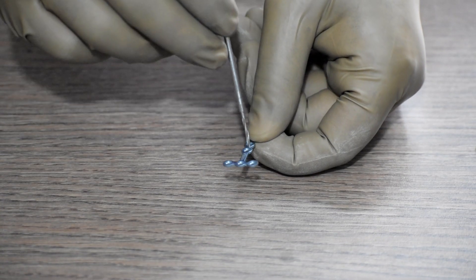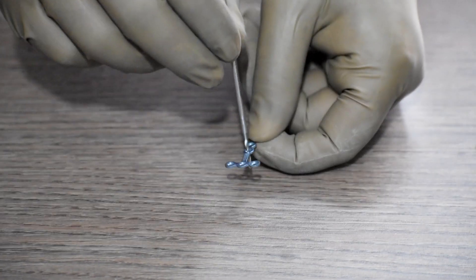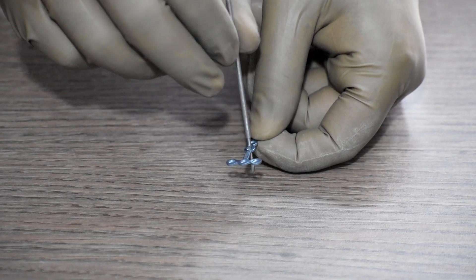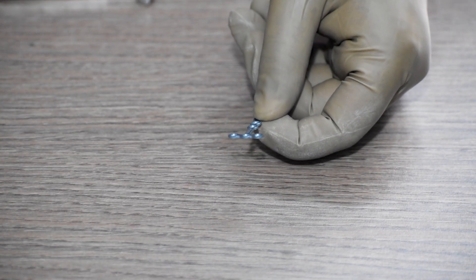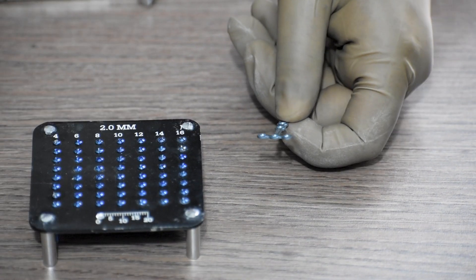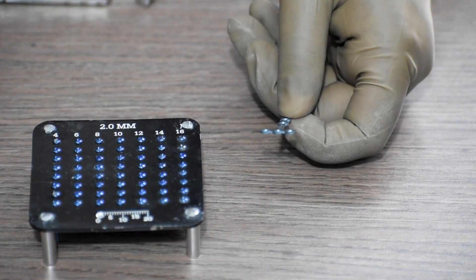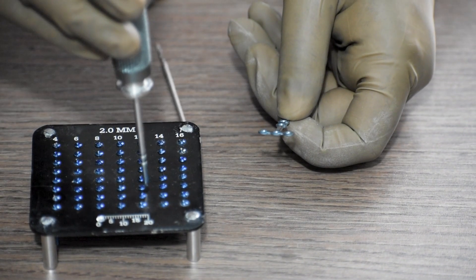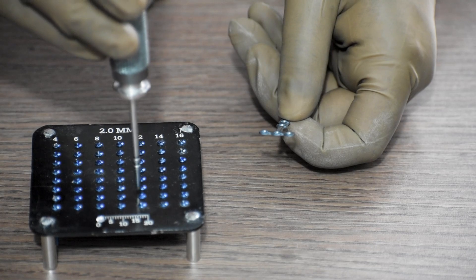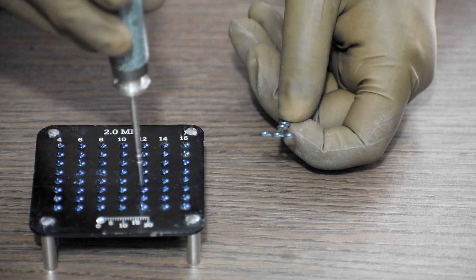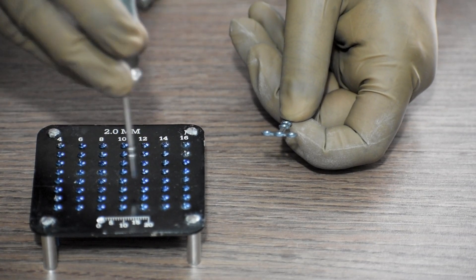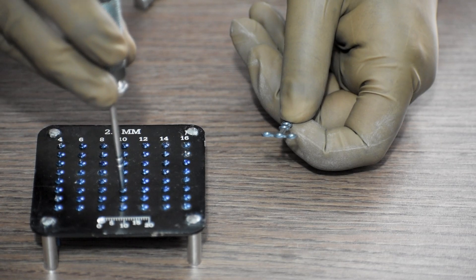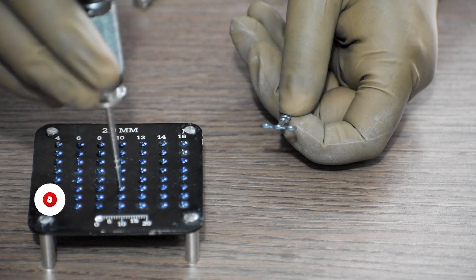Then we will use the 1.5mm drill bit in order to drill through. Then we will take the length of the screw required by using a depth gauge. Thereafter, we will use the cross head screwdriver, take the 2mm mini screw of desired length, and fix it in the plate.